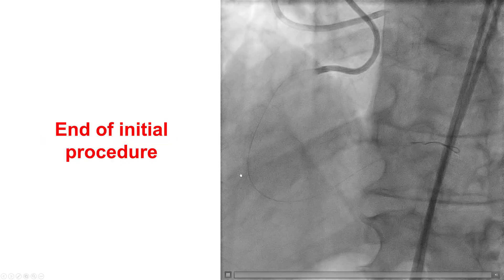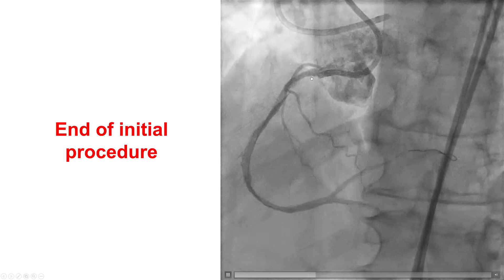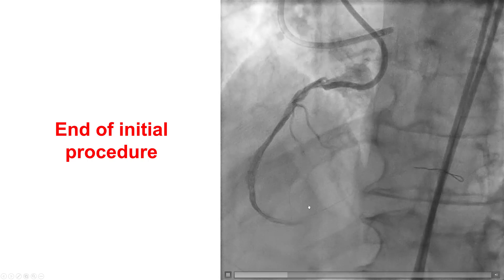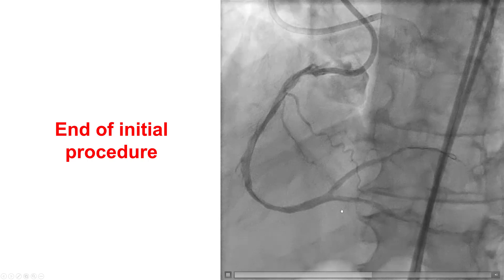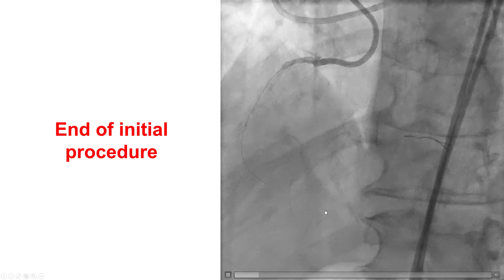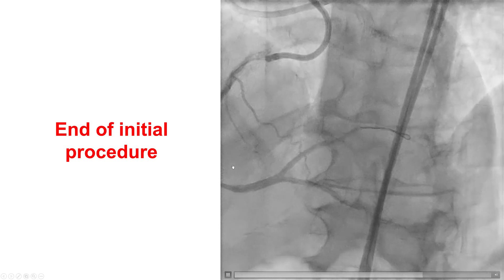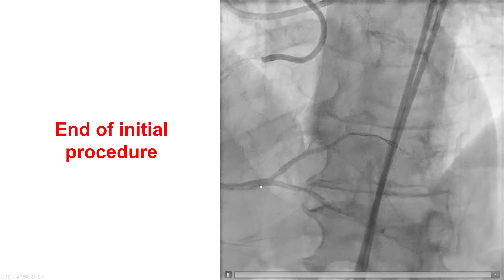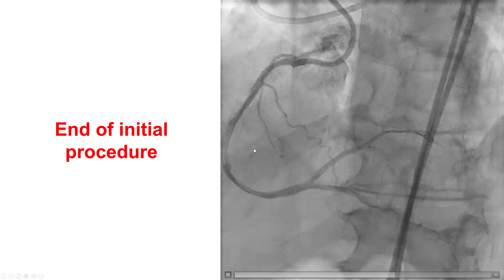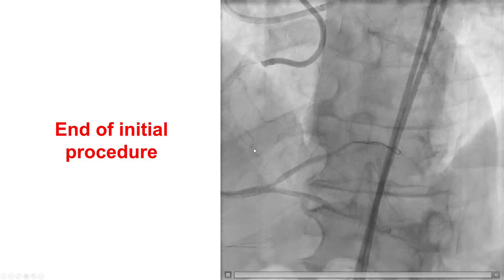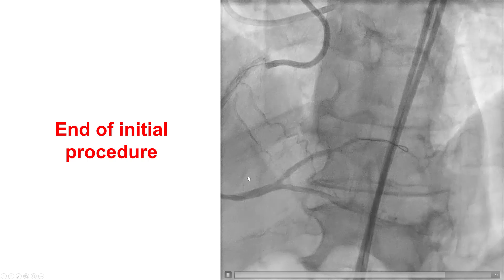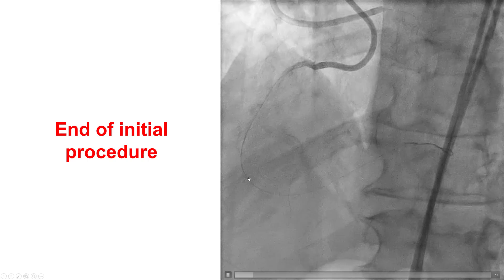There were extensive dissections in the right coronary artery, extending into the PDA and to the right posterolateral. So we did not place stents on the right coronary artery, but instead advised the patient to return for a repeat attempt for re-canalyzing the RCA.